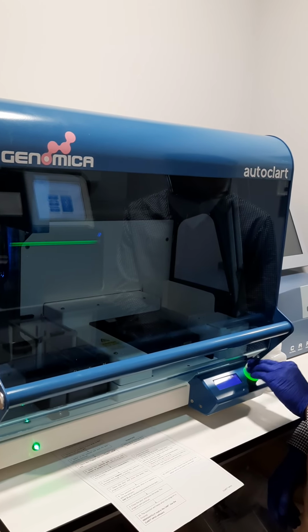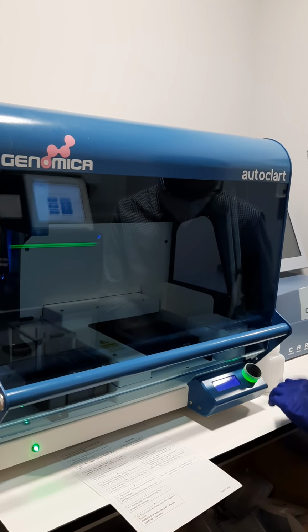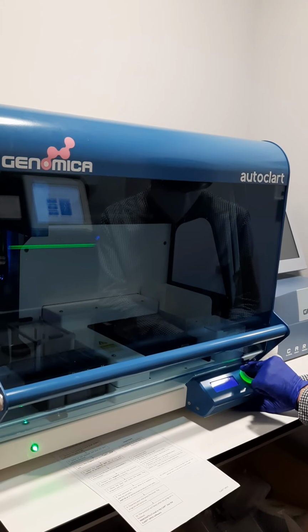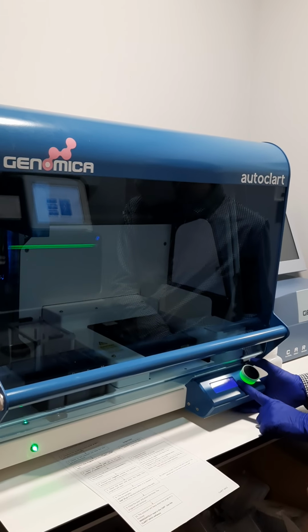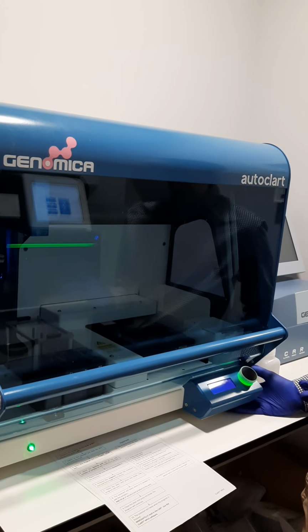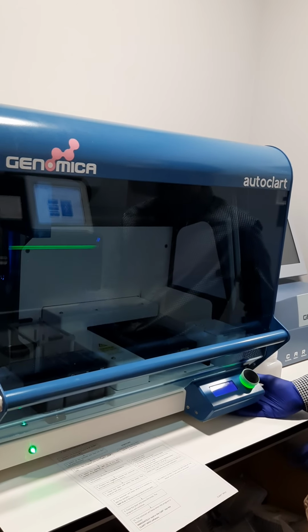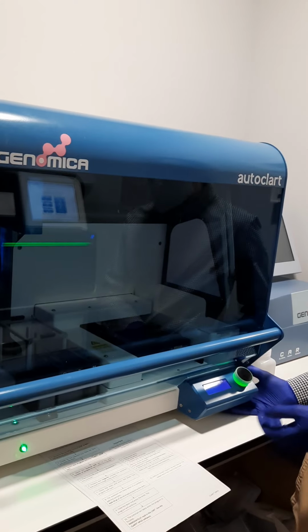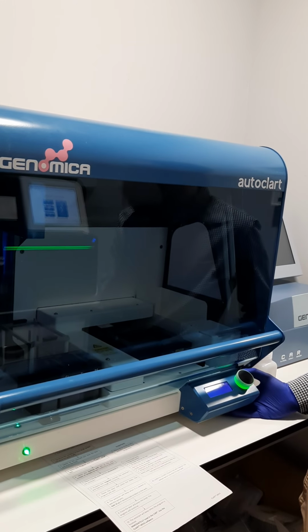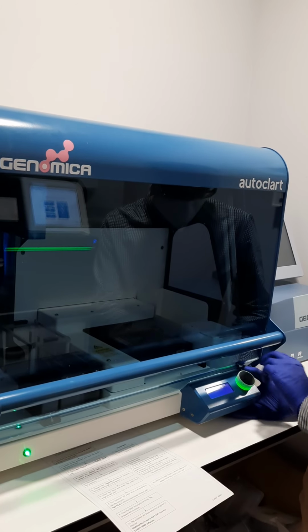In fact, let me go again, start again. HPV4, starting in A1. Here we can select 4. But now in this run that we are going to do, we have also positive controls, so we can include them to check that everything is working and so on. And a negative control in the PCR, for example. Okay, so imagine that we select 8.